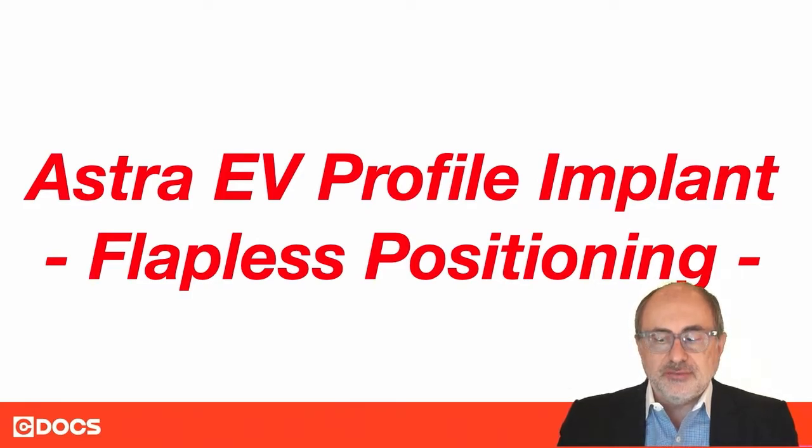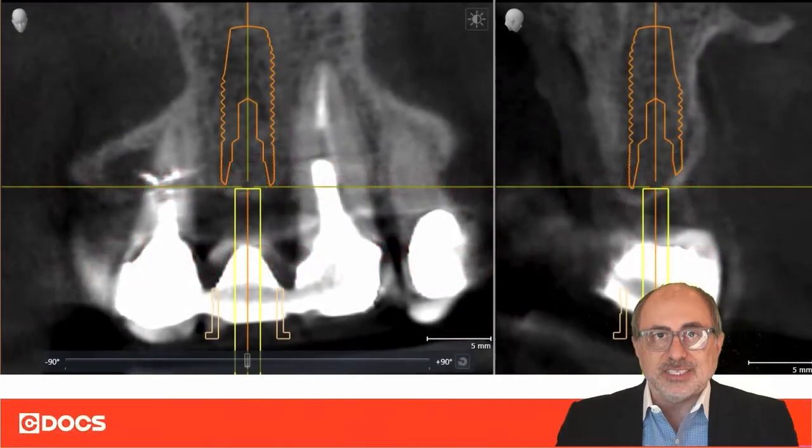The Astra EV implant is a great implant system to use in cases where we have sloped ridges. As you can see here in this specific case, we have a sloped ridge to the buccal, which is often the case after extractions.